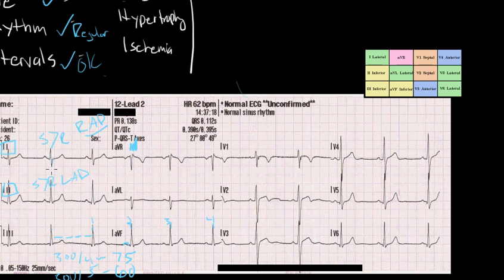So in our patient, our R waves are nice and high, bigger than our S waves, so we know we have a normal axis.